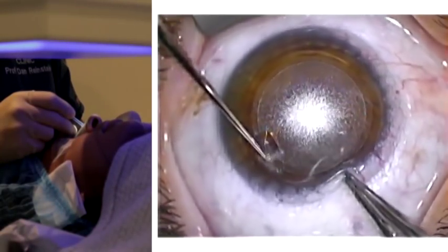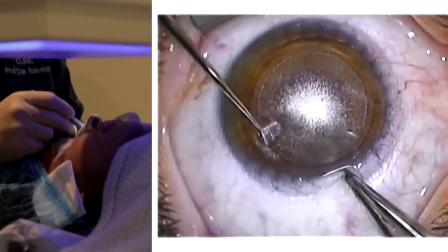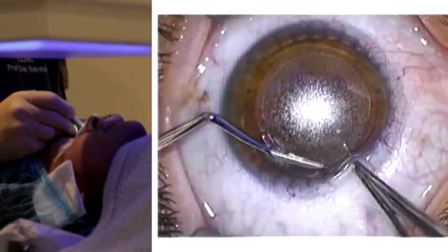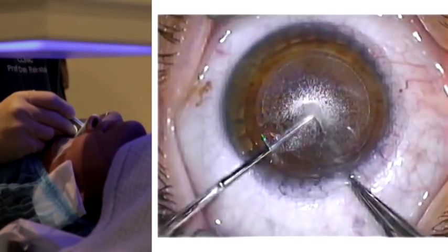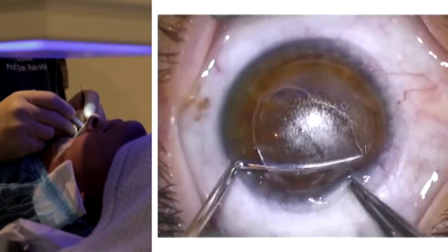We prefer to hold the eye steady for better control using a 0.12 forceps. After opening the small entry incision, both upper and lower interfaces are identified with a blunt hook. The upper interface of the lenticule is separated first using a standard lamellar dissection technique of waving a blunt spatula back and forth through the entire cap.